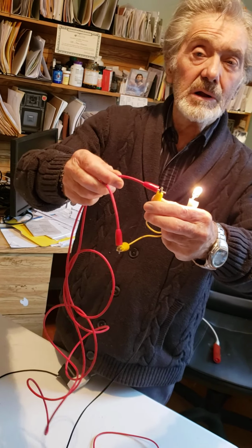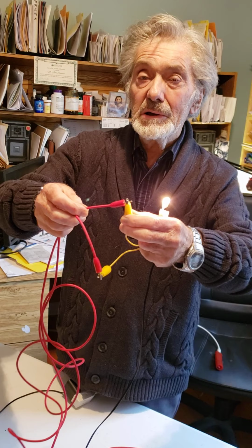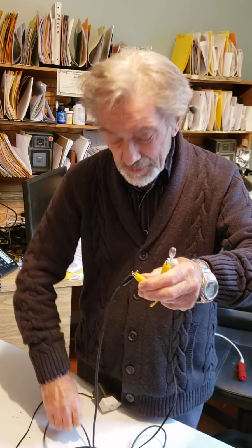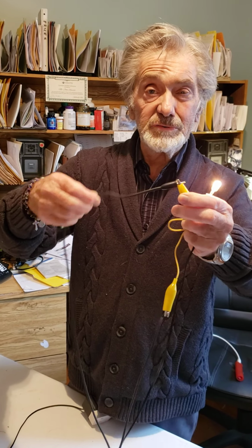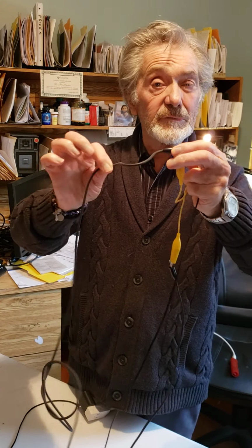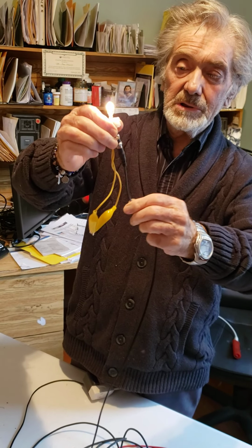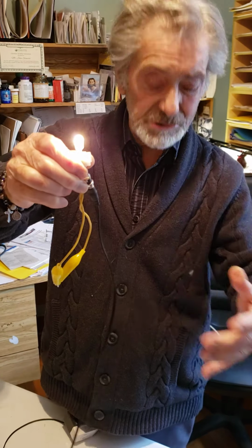This particular cable always gets broken after about a year or so of use, and this is a high quality professional laboratory test cable. So this one's okay. So I check this one. Now put it here from end to end, and jiggle it, and it's fine. Jiggle the other end, and it's fine. If there was a break, it would show up. And then, as I said, to test that power supply, jiggle it. You see, jiggling it, so it makes you think that the whole instrument is faulty, but in fact it's just the power supply.